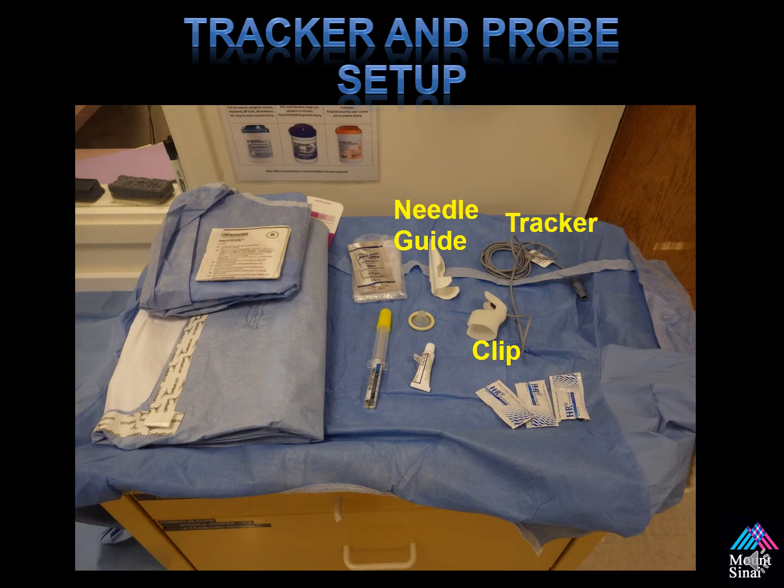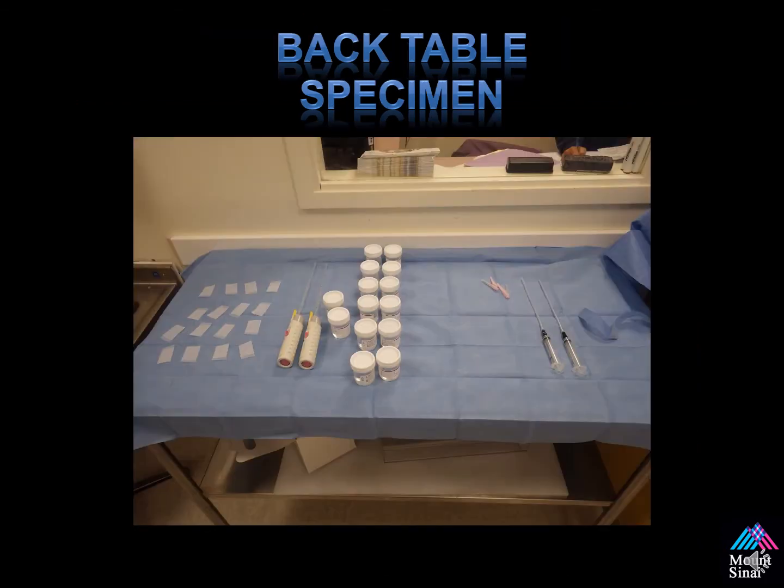This is an example of my back table setup when I perform the procedure in interventional radiology. We have two biopsy needle guns as well as two syringes for lidocaine. We use two biopsy needle guns to allow us to perform the biopsy while the second person is removing a specimen off the first needle, which helps save a little bit of time.